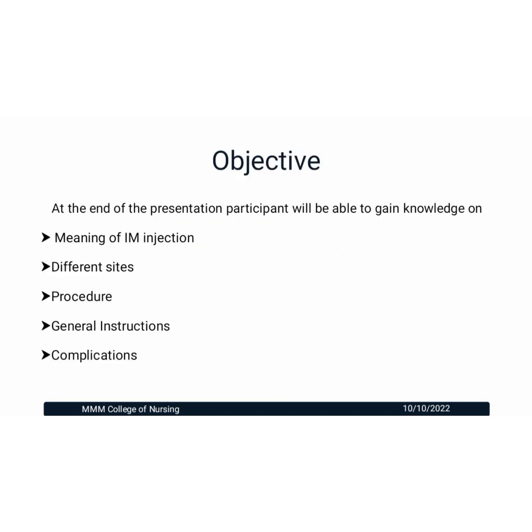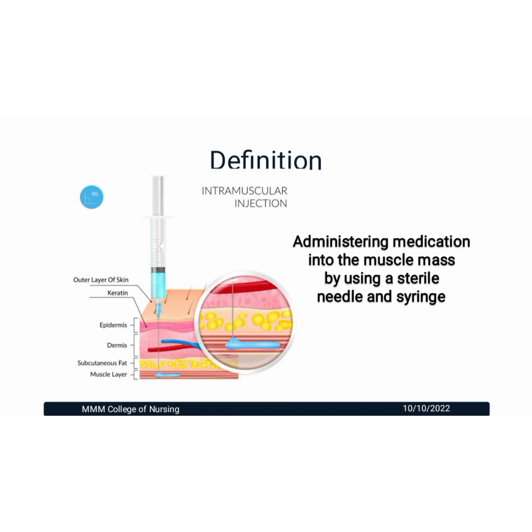This video will be helpful to understand and gain knowledge about IM injection, different sites of IM injection, procedure, general instructions and the complications related with IM injection. Intramuscular injection: administering medication into the muscle mass by using a sterile needle and syringe.